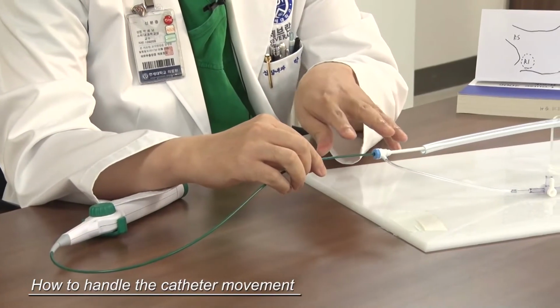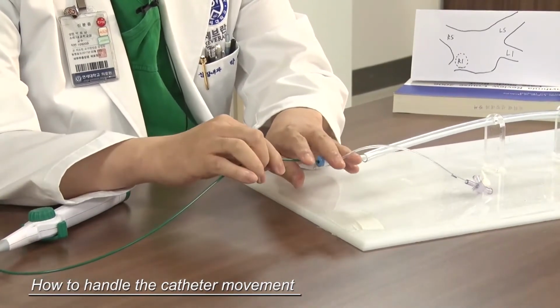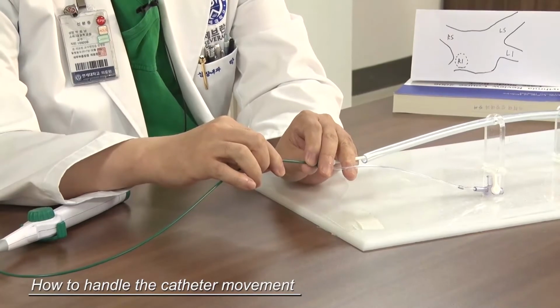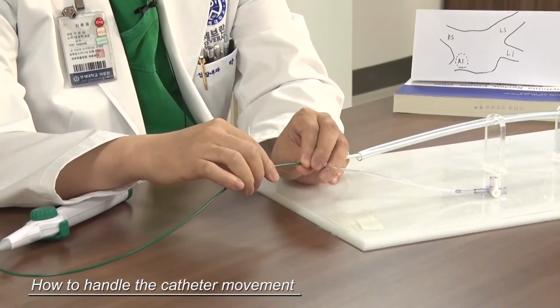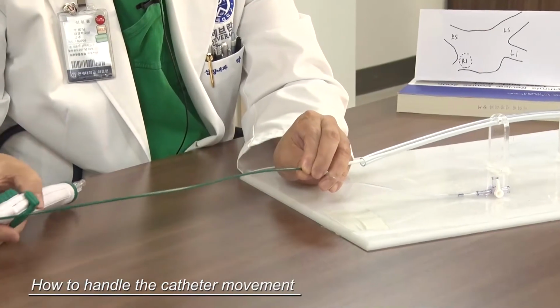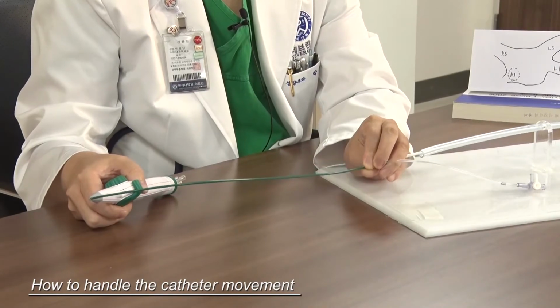So watch my hand. Use the third and fourth fingers to grab around the sheath, and the thumb and index finger grab the catheter. And the clockwise and counterclockwise torque is done like this. So the left hand is more important.